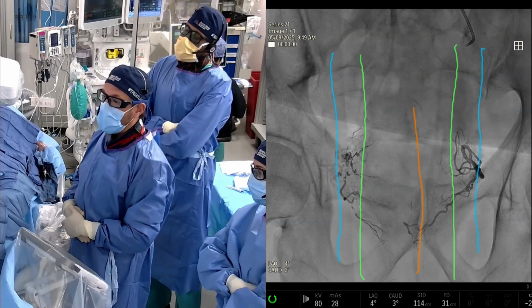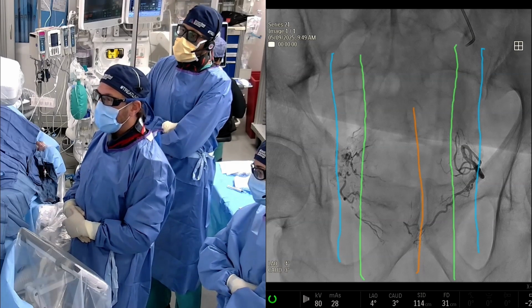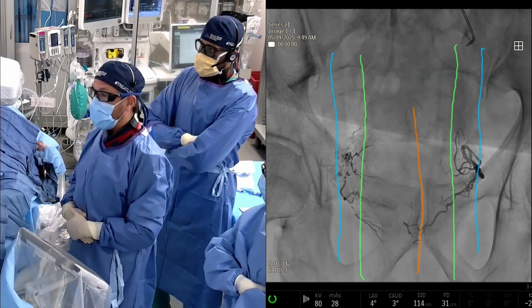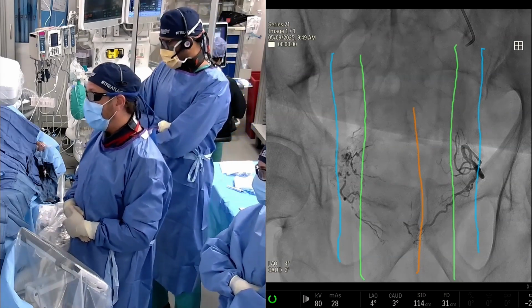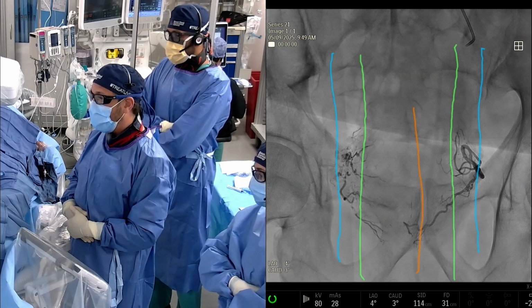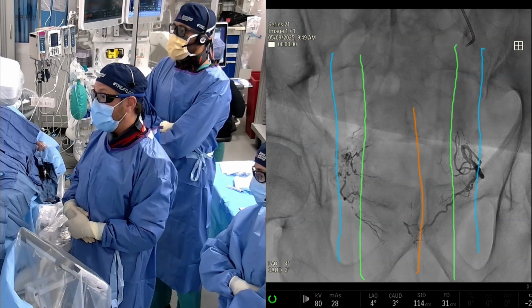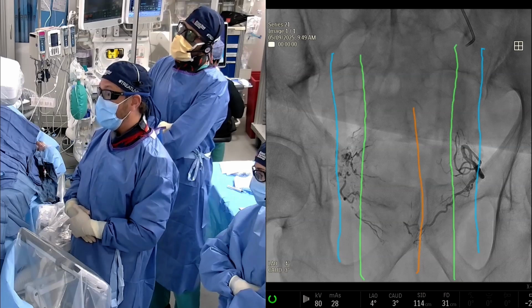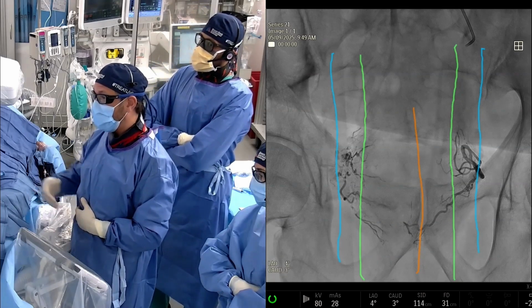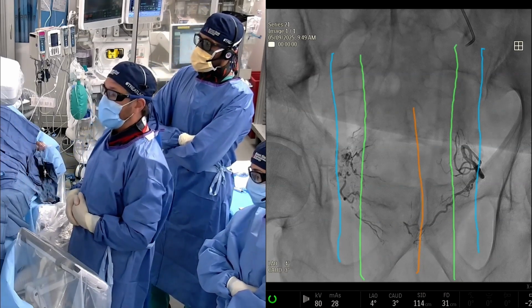But if you're using particles, you would never recognize that. It would have flowed through to the penis the whole time. Exactly. That's one of the reasons why we don't like particles anymore. We do think that liquid embolics, particularly adhesive agents like n-BCA, are safer if you have experience using them, because we have the ability to start and stop our injection with our hand, as opposed to particles, which are entirely flow directed.